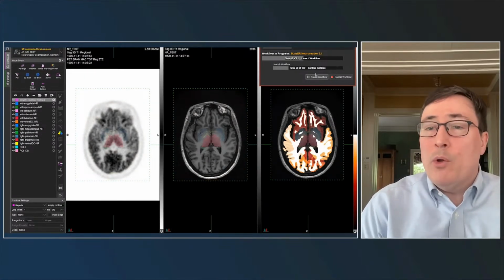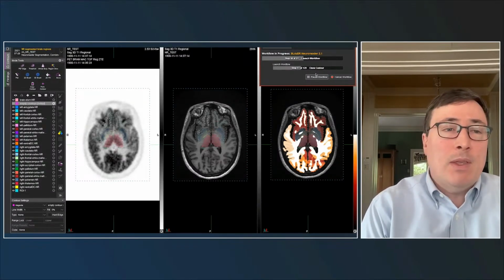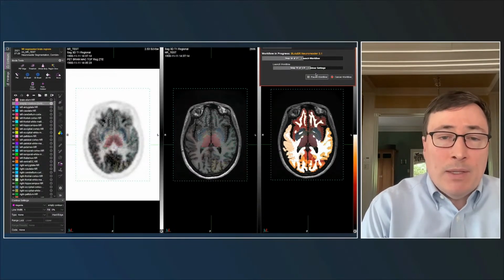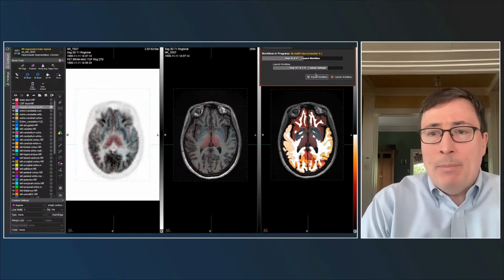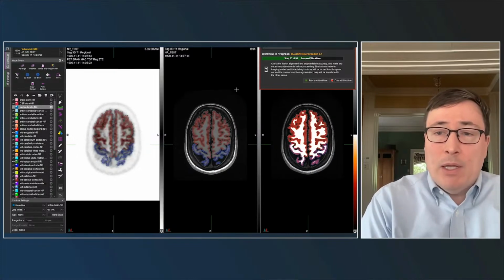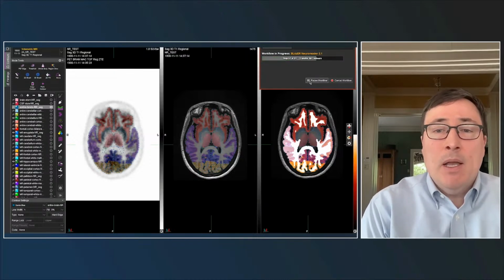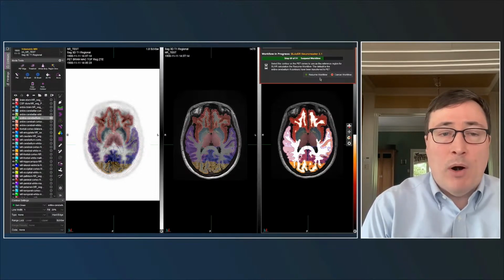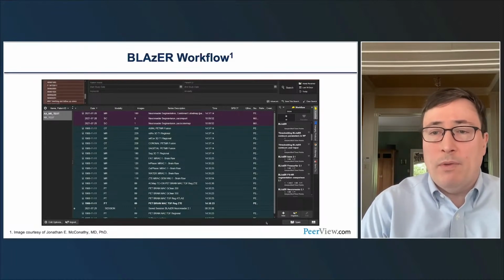I don't want to pretend that we're the only ones who do this, but I want to show you how this might look in routine clinical practice and make you realize that this is something that a technologist or a physician could easily do in a routine workflow. And I think this is going to become increasingly important as we quantify amyloid and tau in specific brain regions, both for deciding whether therapy is appropriate as well as for deciding whether or not to stop therapy based on clearance. And you can see in this scenario, we're able to review the contours, the brain regions on the original MR as well as on the PET, which gives us confidence that the brain regions are faithfully being quantified and identified.